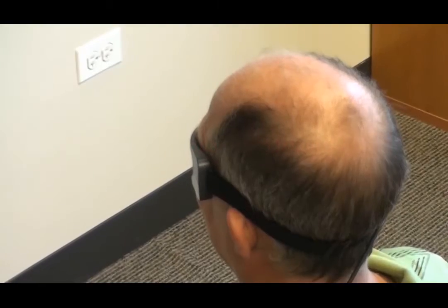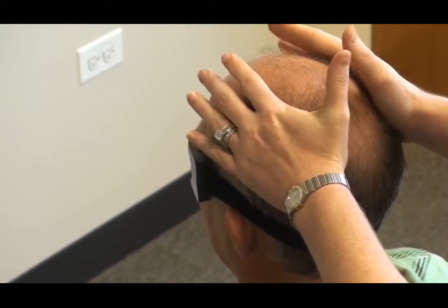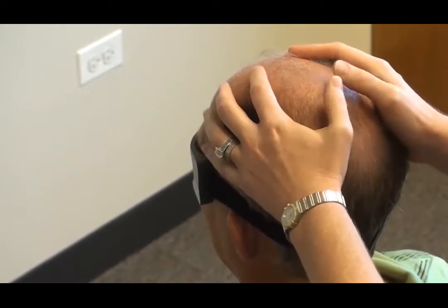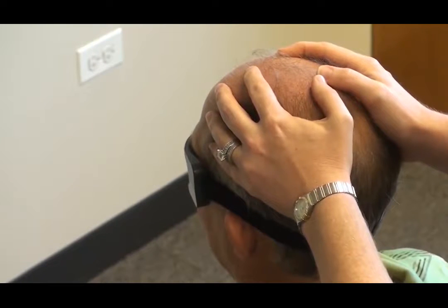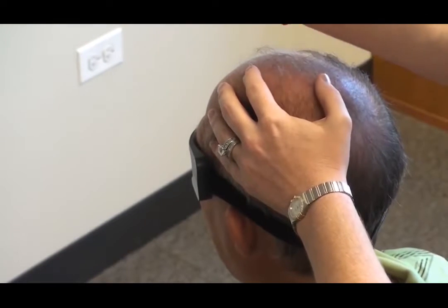Now, how do you ensure you're doing proper head impulses? You want to make sure that you hold tightly to the head. You can do this in one of two ways. I have a tendency to push down at the palms and then hold at the tips of the fingers. Some people like to hold more at the tips of the fingers, but you want to make sure you hold onto the head firmly when you are doing your head impulses, because you are going to want to do a short amplitude, so from point A to point B.